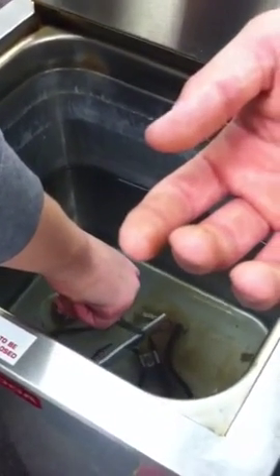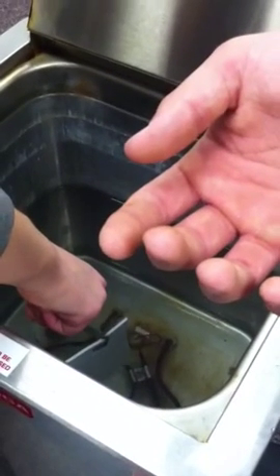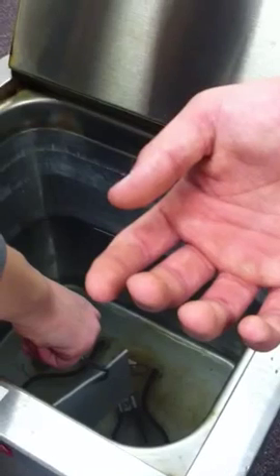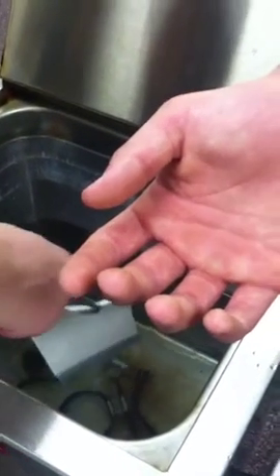So take your piece of plastic over to the hot hydroculator. You're going to heat it up with tongs. Be careful, as the temperature is about 180 degrees in the hydroculator. You're going to pull it out.